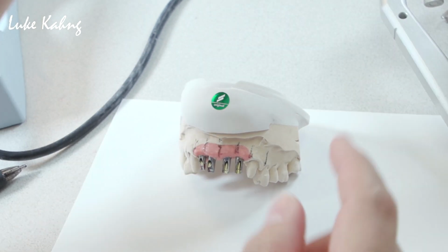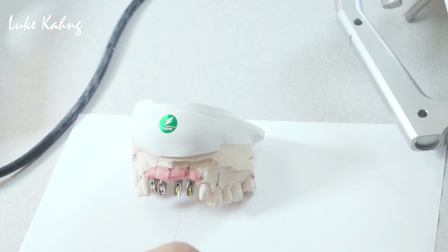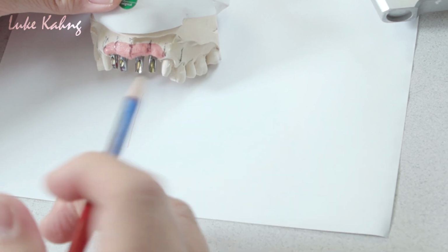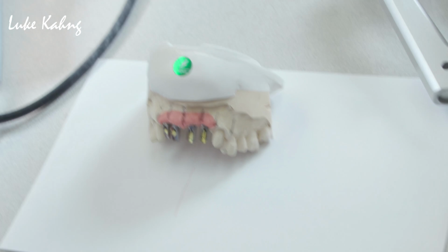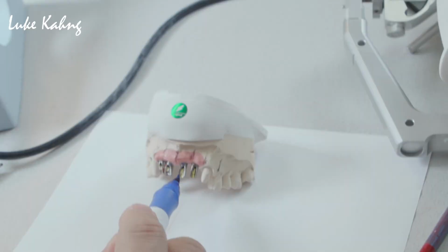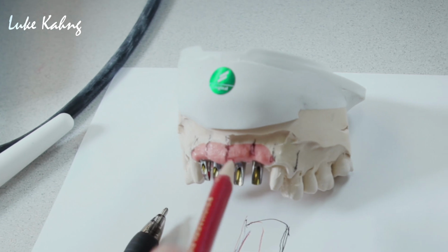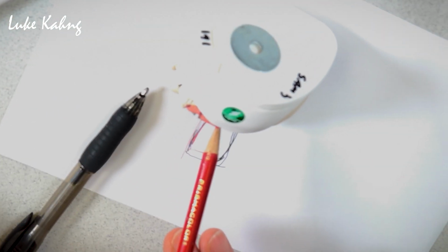So, whenever I see this, the midline is here, you see, the midline, I cut it, and then here is a little bit too much, so I want them to grind it. I want them to grind this area. Okay, why? Here is the 1-2, and this is too close. So all the time look at the final contour. Then draw the final contour like I did.